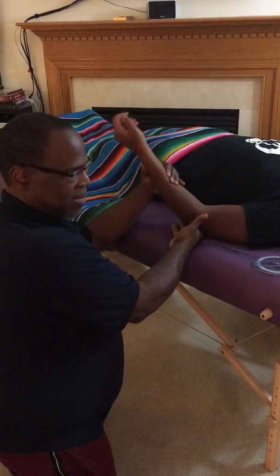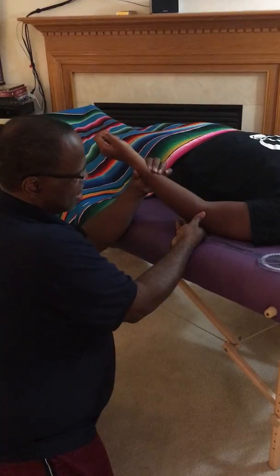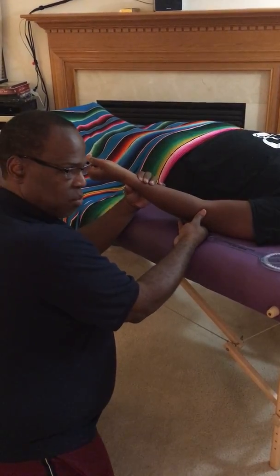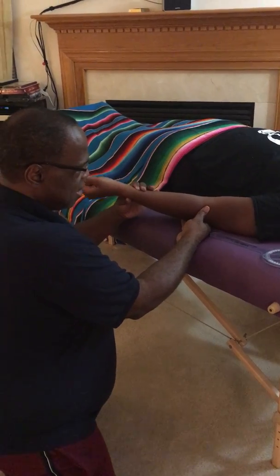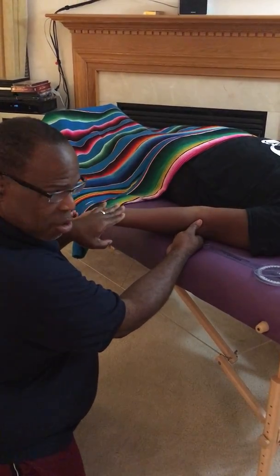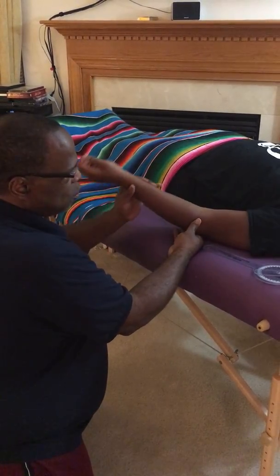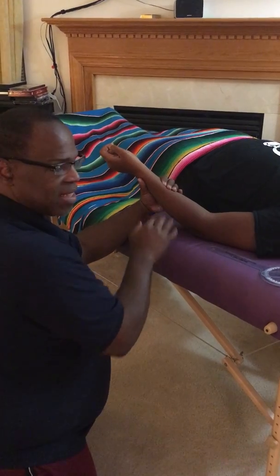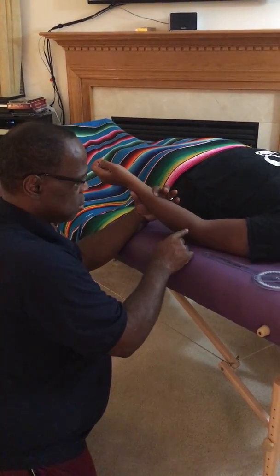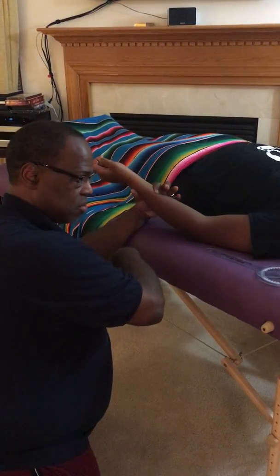When would it be a positive number? If this is negative 40, if I come here, I would assume that that is negative 30, negative 20, negative 10, 0, and if for whatever reason she was able to go beyond that, then it would be 0 to whatever number that is. So when a person is sitting in the opposite direction, this is considered a negative number if we're talking about the opposite direction.